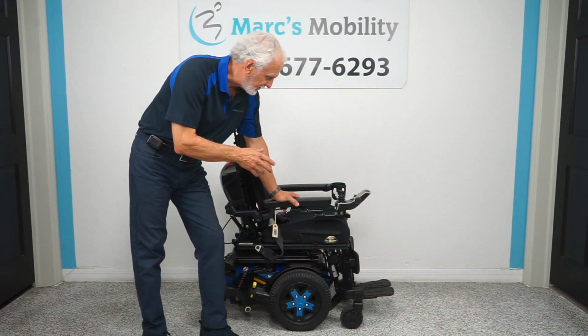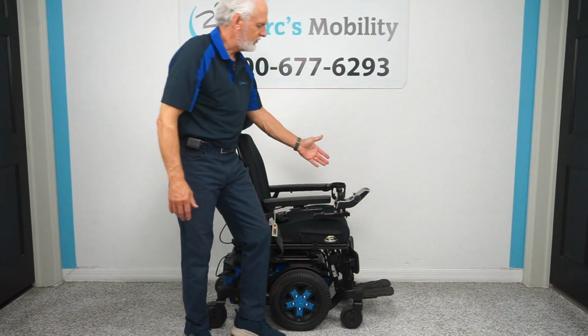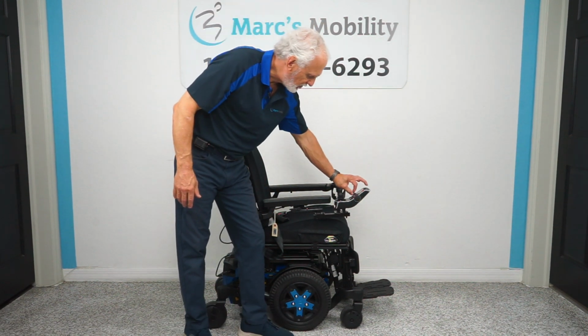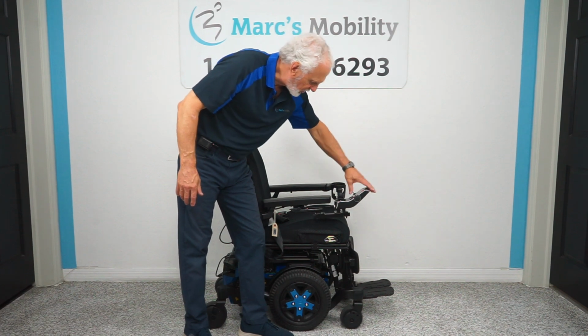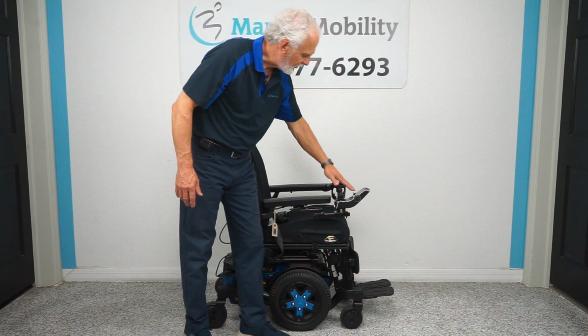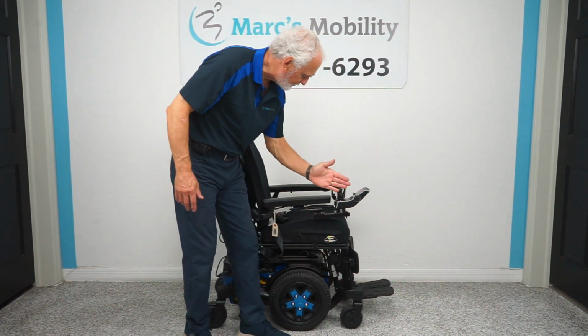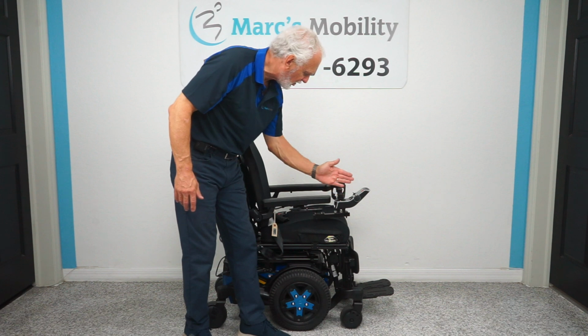So this one has electric tilt, electric recline, electric feet. All the functions need to be worked through the joystick. So you go right here where you turned it on. You're going to keep going forward until you see a picture of the seat. If you want the tilt, you're going to want to have the bottom cushion and the back cushion yellow. If they're not both yellow for tilt, just keep moving the joystick sideways until you find the color you need.